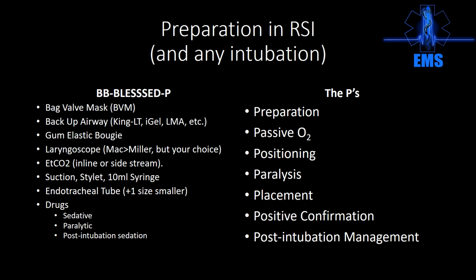So as soon as you stick the blade in the mouth, that's an attempt. Once we've intubated the patient, we need positive confirmation. You guys need 2 forms of positive confirmation in order to say that that tube is where it's supposed to be. The best and most universally accepted is end-tidal CO2 with a graph readout.